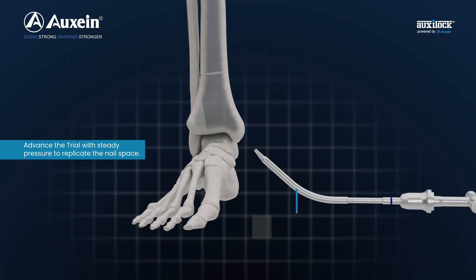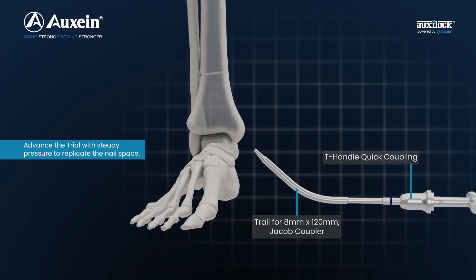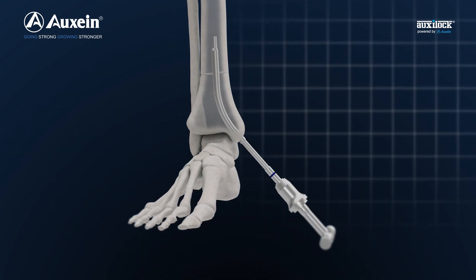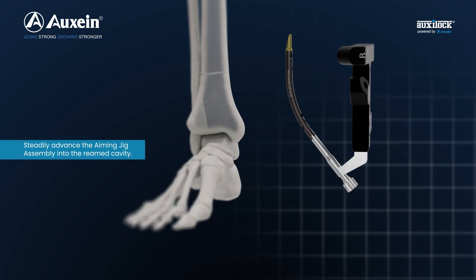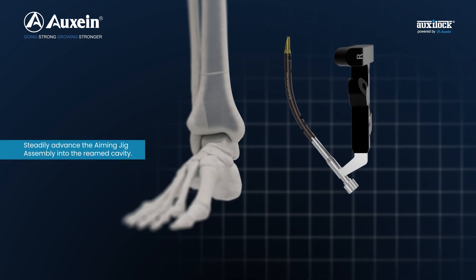Advance the trial with steady pressure to replicate the nail space. Steadily advance the aiming jig assembly into the reamed cavity.